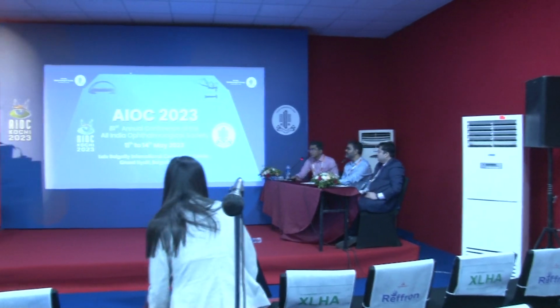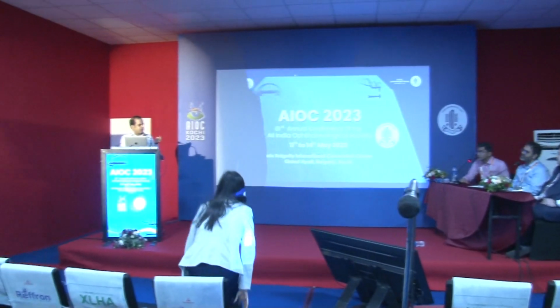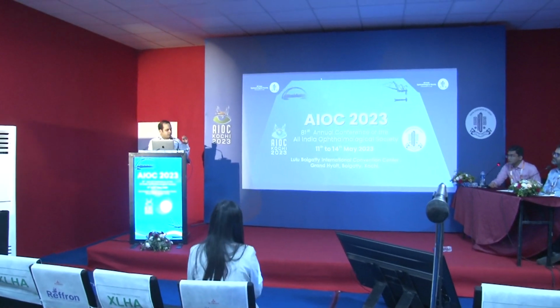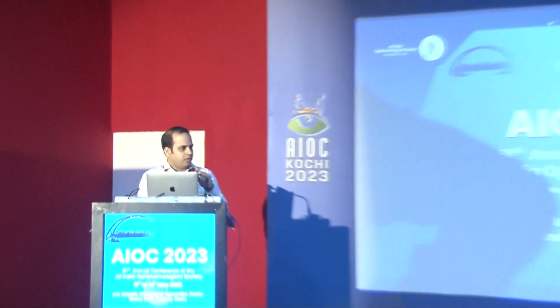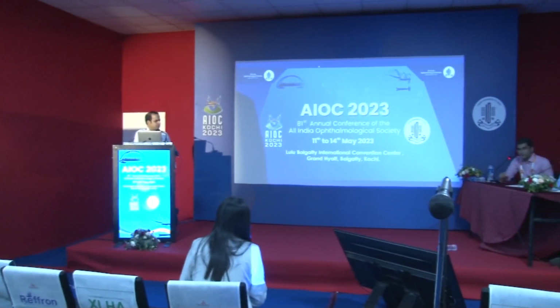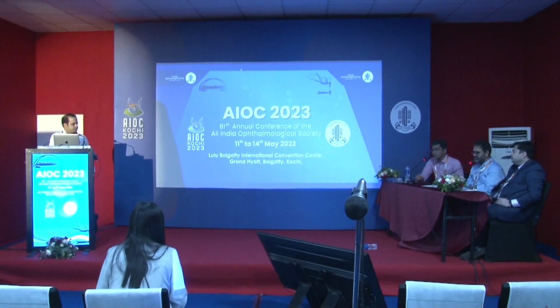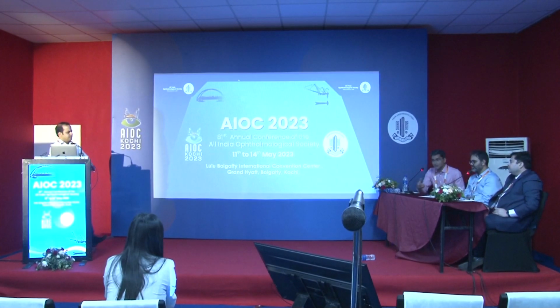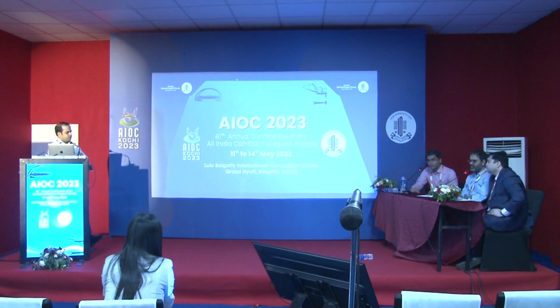The hole, I think, was formed with the jet of the triamcinolone. Maybe that was the mechanism of its formation, because when I hit the jet, I could see it at that moment. I'm not sure whether it was due to the PVD or because of the jet of the triamcinolone. So I feel the reason for the hole occurrence is that it was already tented for a very long time and would have got thinned out. When we are inducing a PVD, that's the thinnest part of the retina, and it has just yielded. And because of the PVD, there is an anterior-posterior traction, and that itself is the mechanism of hole formation.